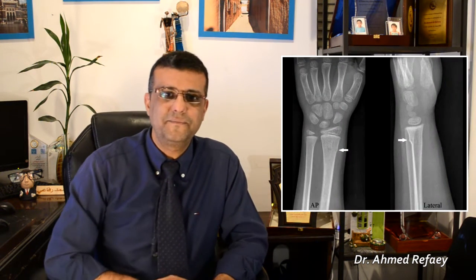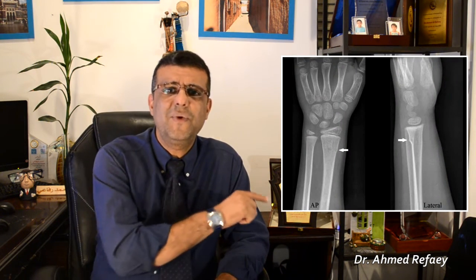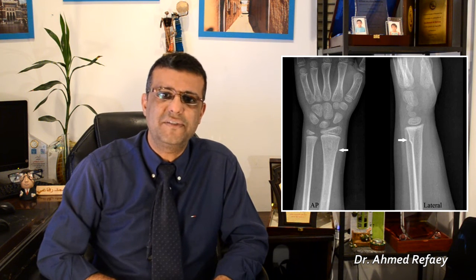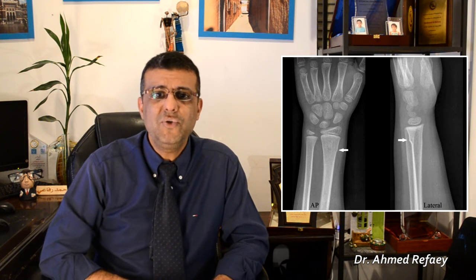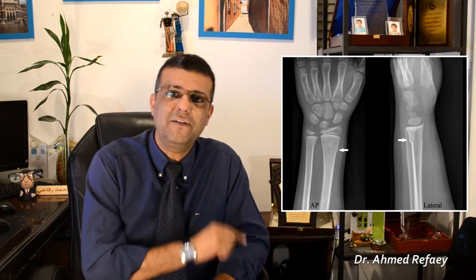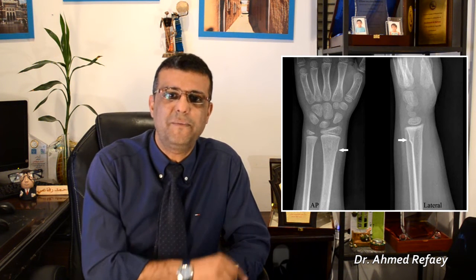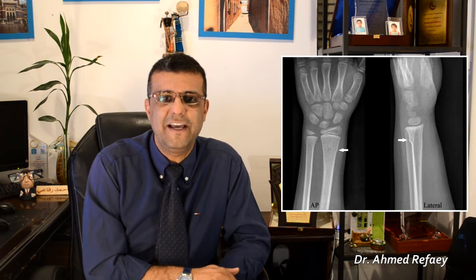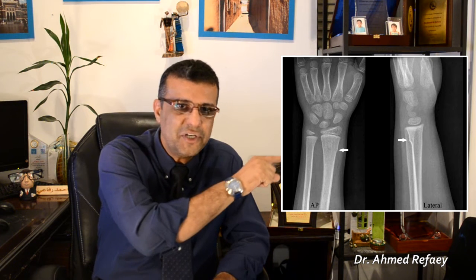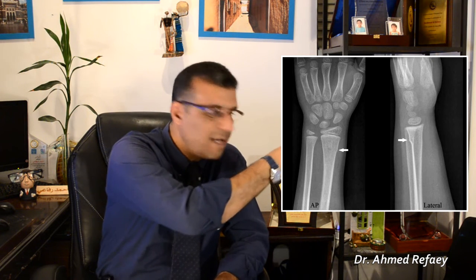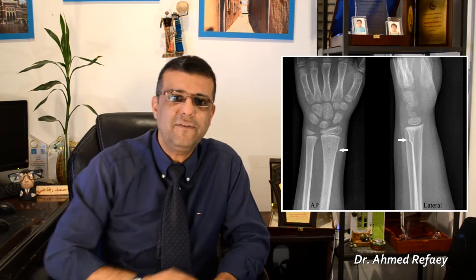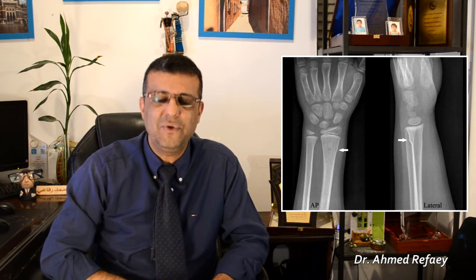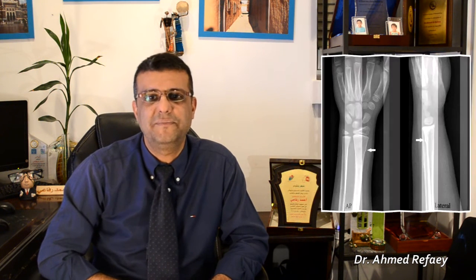Case number six is one of the easily missed fractures — the torus fracture. It is usually very difficult to appreciate in the frontal projection, and better detected in the lateral projection in the form of angulation or bulging of the cortex as you can see here. It is an incomplete fracture, also known as a buckling fracture.